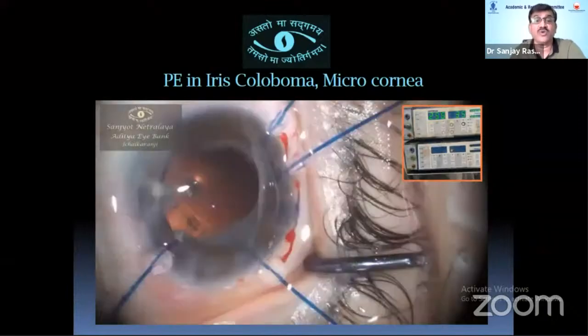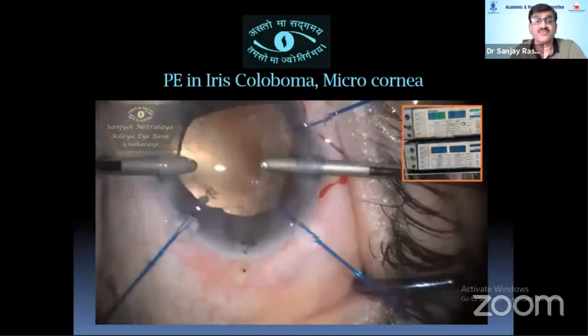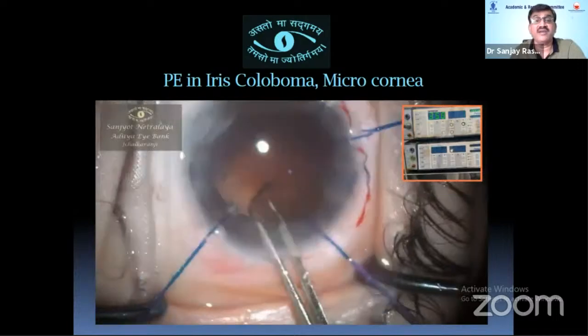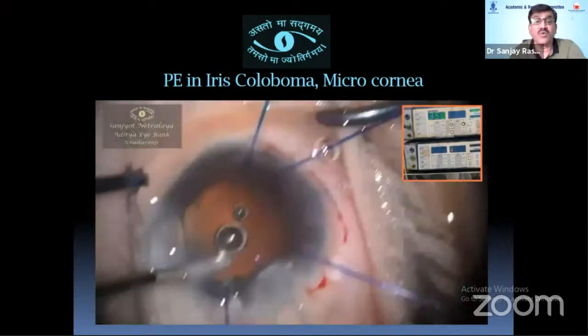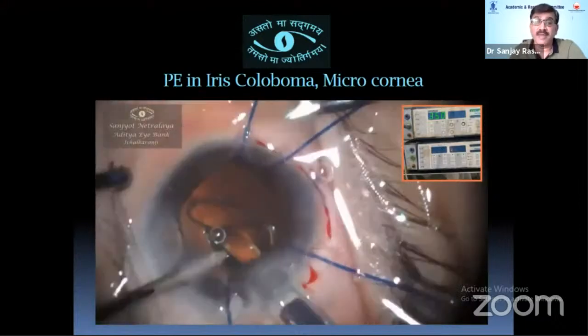Once phaco is completed, the loose cortex is aspirated with bimanual IA, but accidentally the CCC got torn at 5 o'clock position. Fortunately, the fibrotic element saved my day, and microforceps were used to remove that tag curvilinear. A 3-piece hydrophobic IOL is then injected, partially into the bag and partially into the anterior chamber.